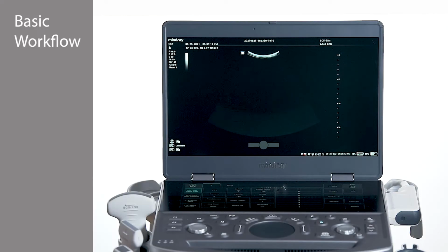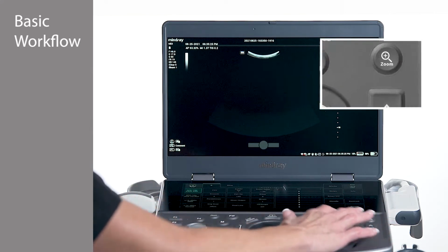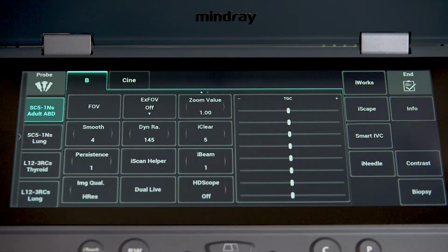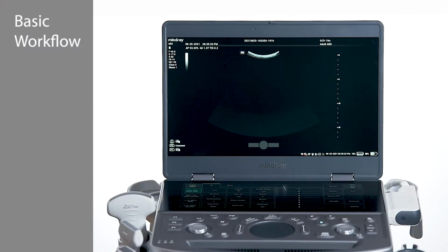Now the system is ready to scan. The ME8 features a streamlined keyboard and a customizable touch panel. The main controls for depth, gain, modes, zoom, and save images are found on the control panel keys. Imaging parameters and other functions are found on the touch panel. An application specialist will assist in customizing the touch panel tabs and programmable keys upon installation.